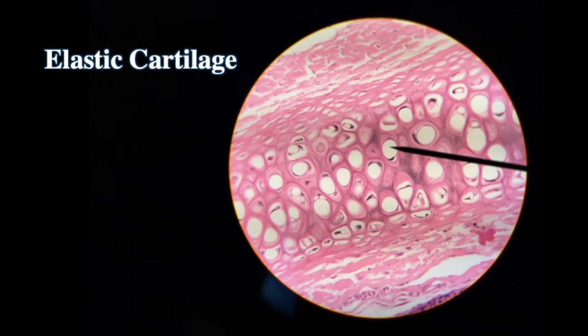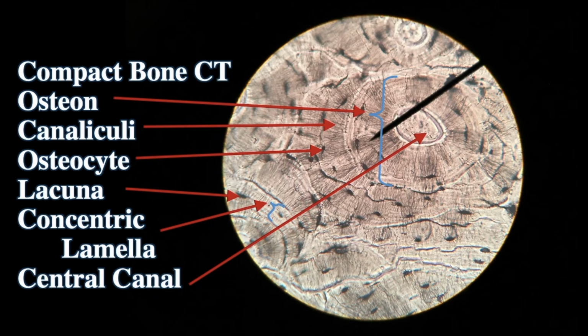Elastic cartilage. All right, this is compact bone. Compact bone. Make sure to say the whole word, compact bone. I mean, the whole thing really is compact bone connective tissue, but people don't really talk like that. Compact bone.